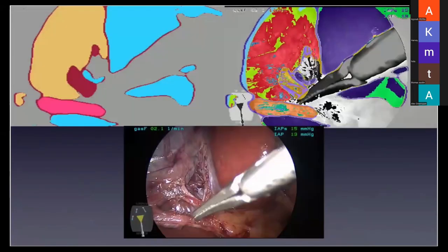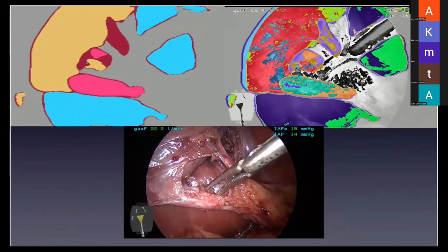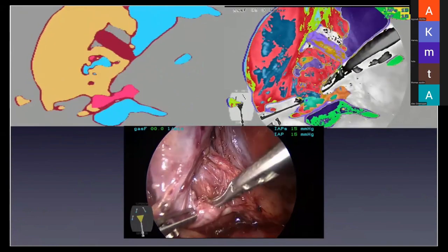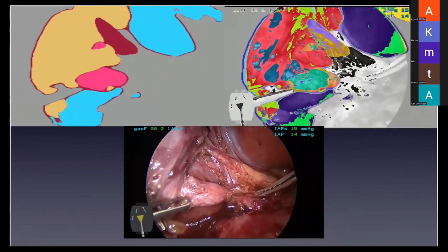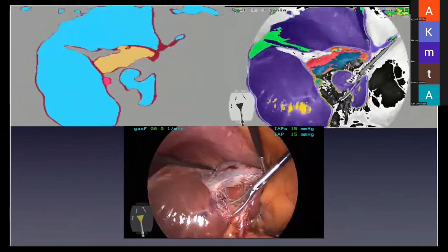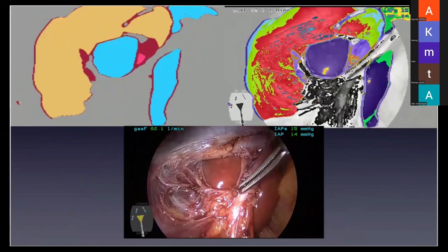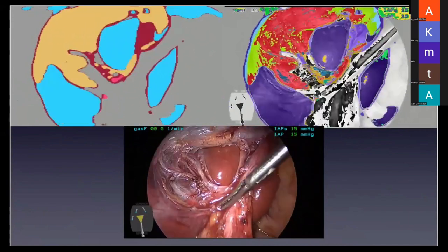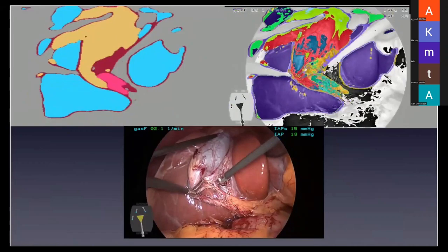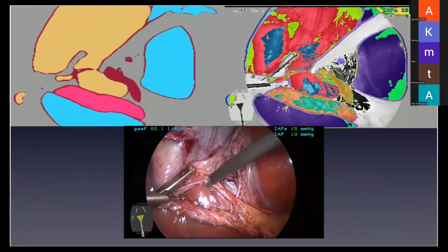Here we have a video that the surgeon looks at. It's not at real time. We try to reach real time, but it can help the surgeon see in different views how the surgery happened and can give good feedback. You see how, even with the flipping, the system can still predict, and we can manage the speed and the colors, so the surgeon can see exactly what he wants, what he can benefit from this video.